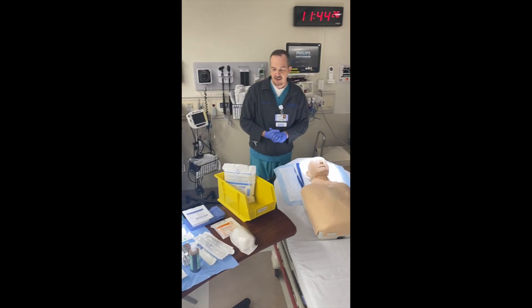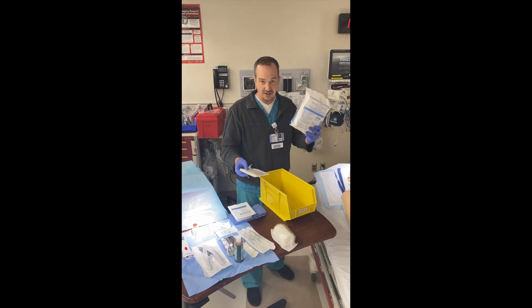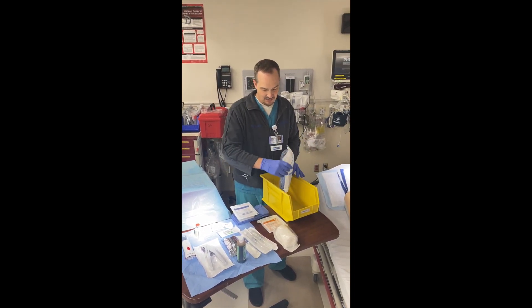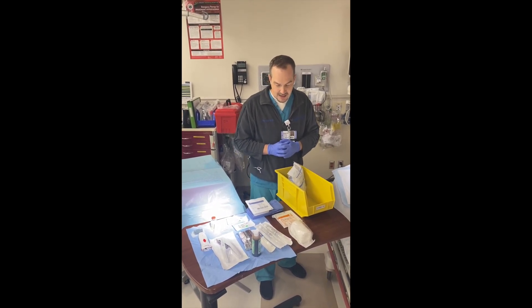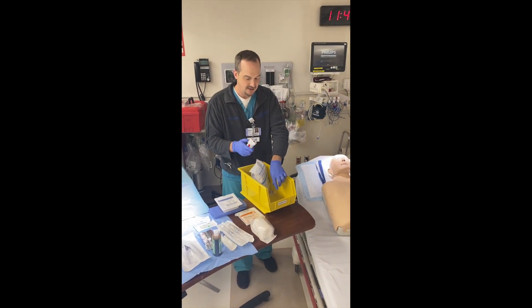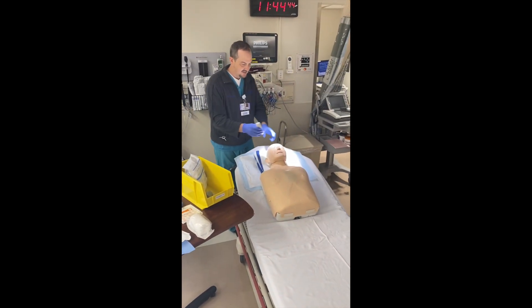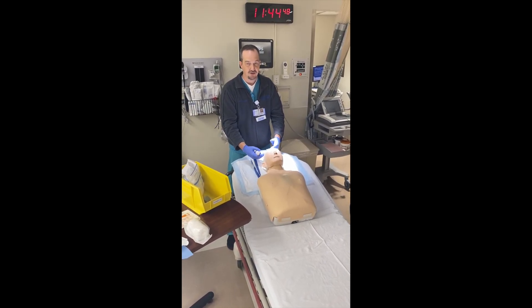We're going to need a sterile gown, sterile gloves, a hat, and a mask. When we get to the sterile component, we'll have that stuff all ready. Typically what we'll do is start with the shaver — connect it, turn it on — and we'll typically shave almost half the head, especially in the frontal bone area.